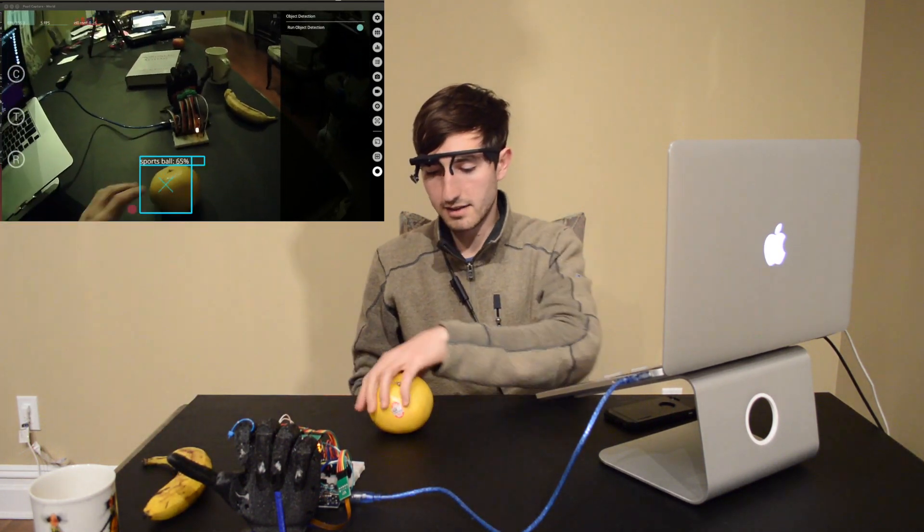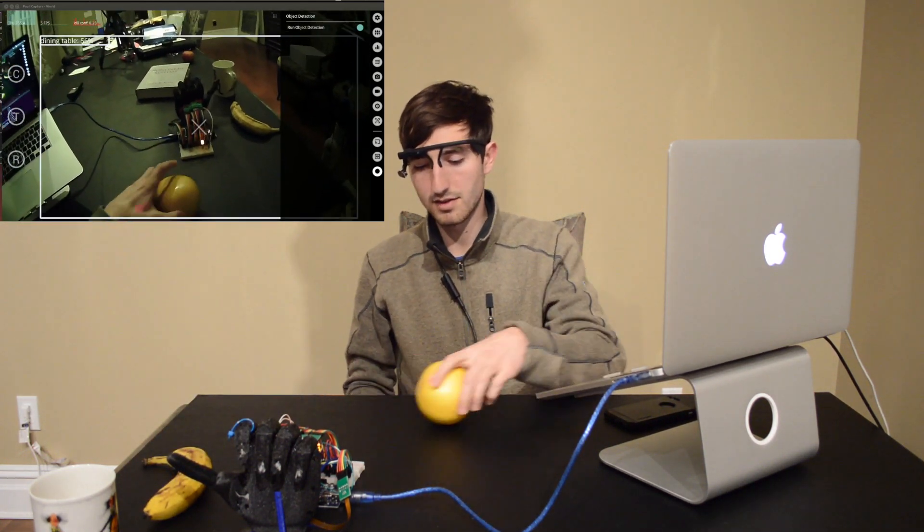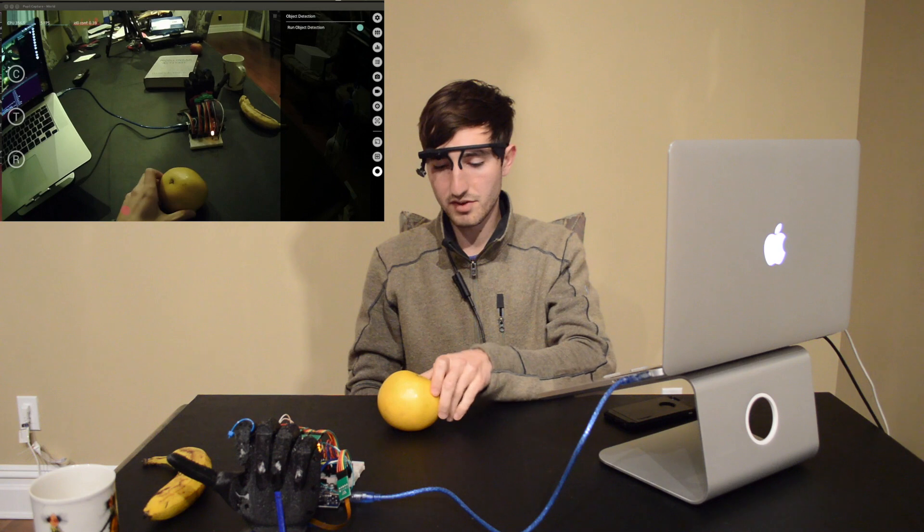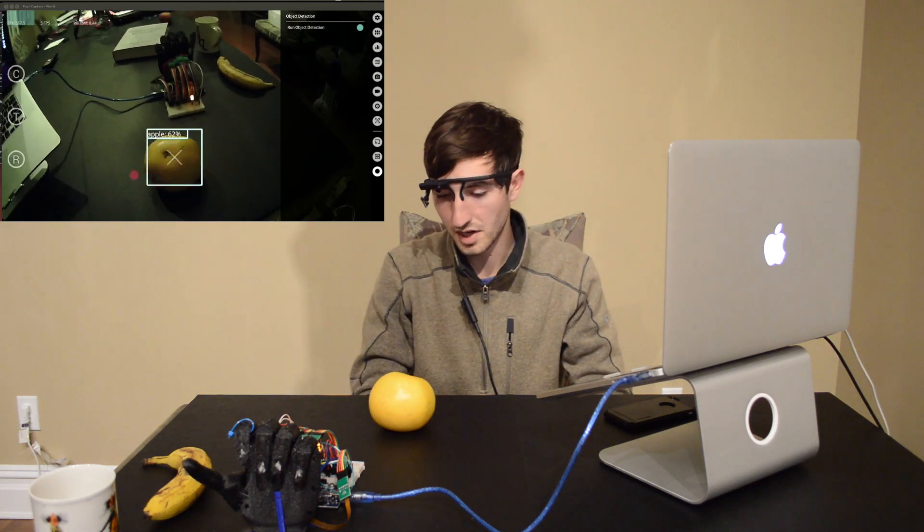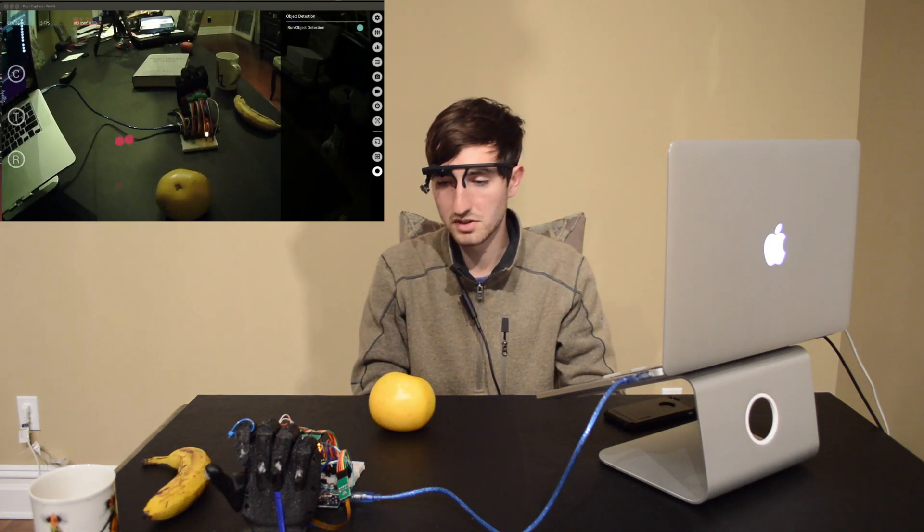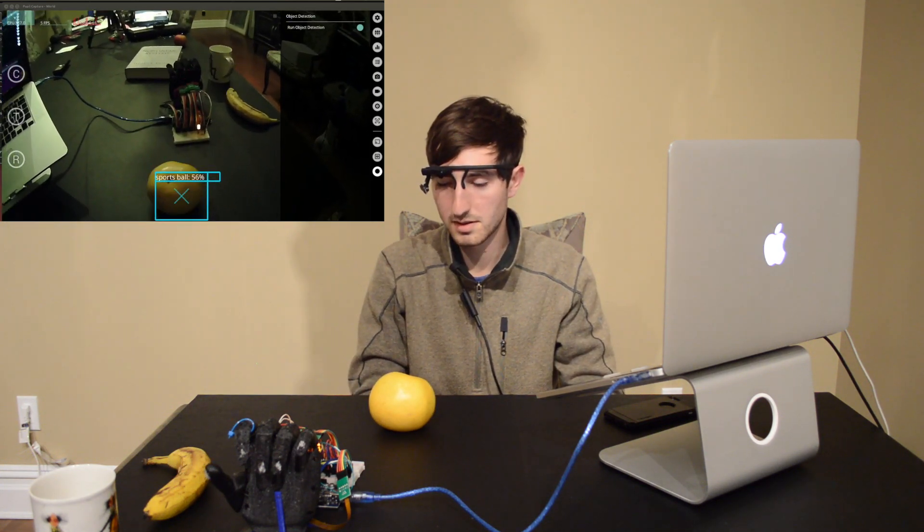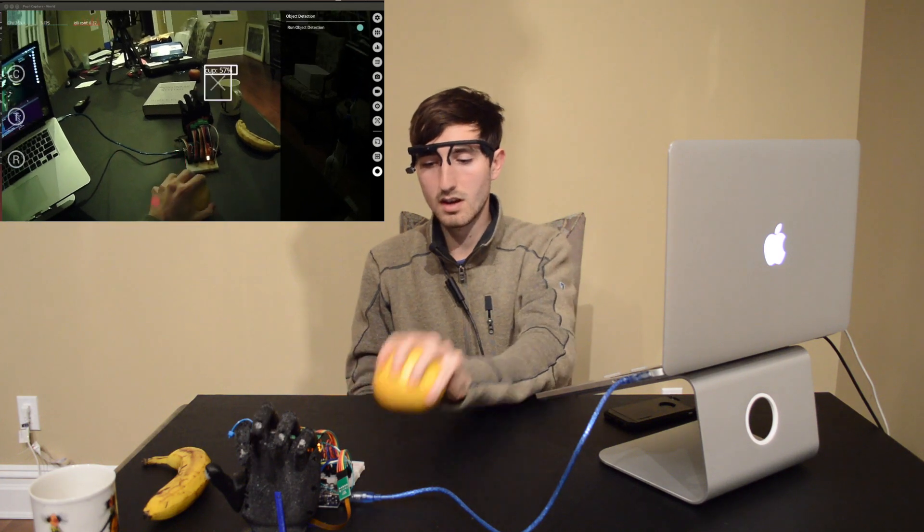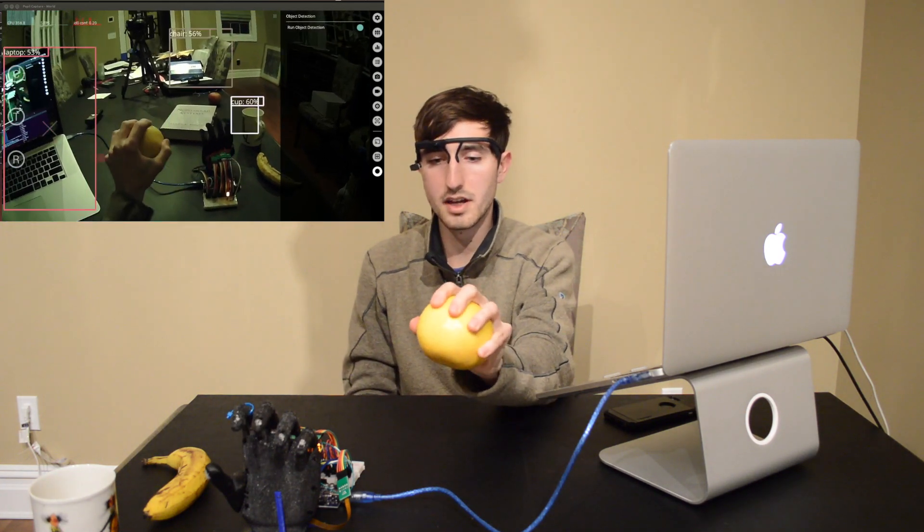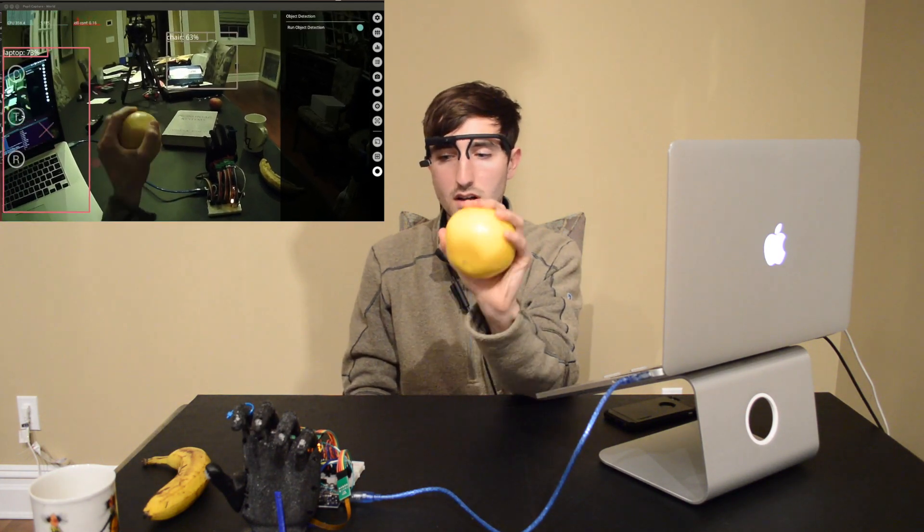Let's try if it knows what a grapefruit is. Apple, grapefruit, probably use the same grasp. And there you have a grasp for an apple.